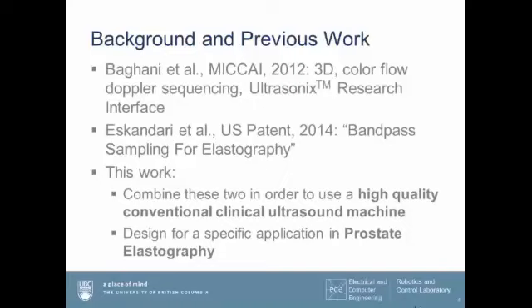So as a background for previous work that we've done, Ali Baghani has done a 3D system. He used color flow Doppler sequencing to track the tissue and provide a high enough frame rate. Separately, Hani Eskandari, along with other people in our lab, have developed a bandpass sampling technique for elastography.